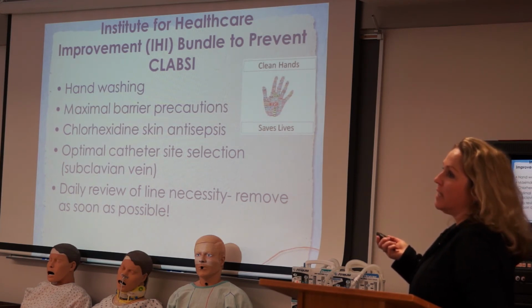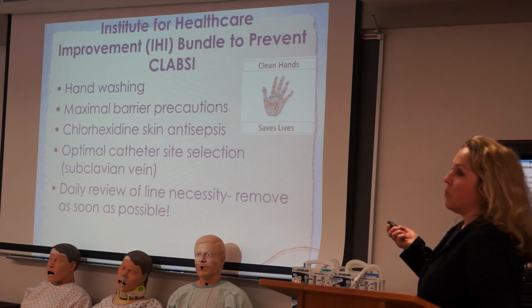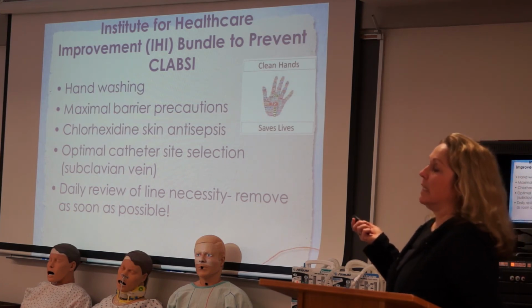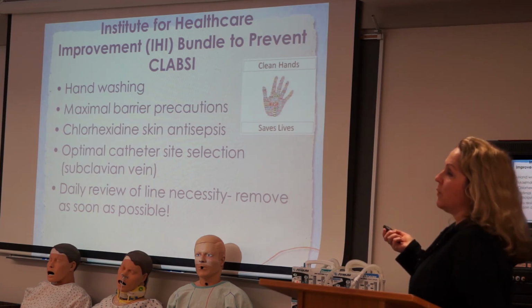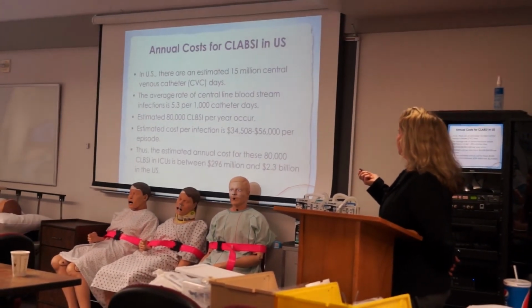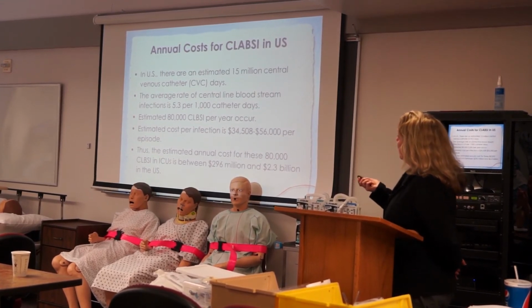You should be assessing your IVs as part of your assessment in the morning right away. I've caught lots of things first thing in the morning that the night shift might not have seen, because it might not have happened when they first did their assessment. But you should be continually, especially if your patient has a central line, assessing that line throughout your shift. It shouldn't just be a one and done situation. You should be looking at that line frequently to make sure that it's still patent and not becoming infected, with no issues with it.